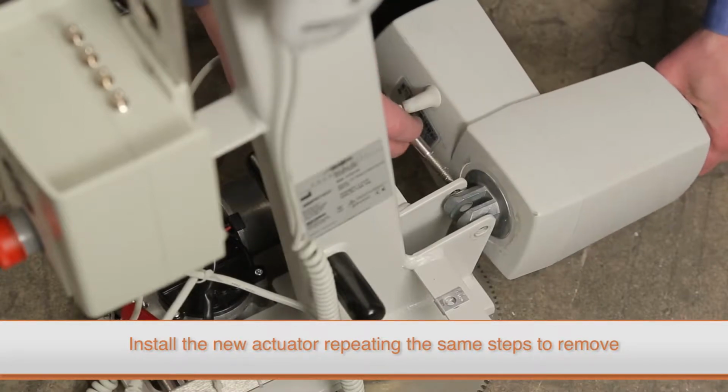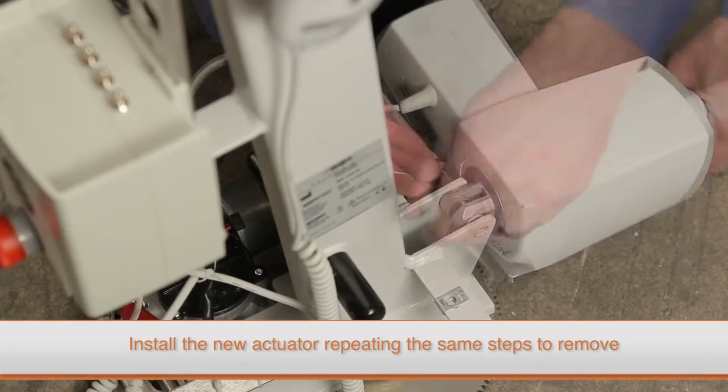Install the new actuator, repeating the same steps used to remove the old one. Make sure the two sleeve bearings on each side of the support arm are installed correctly during reassembly.